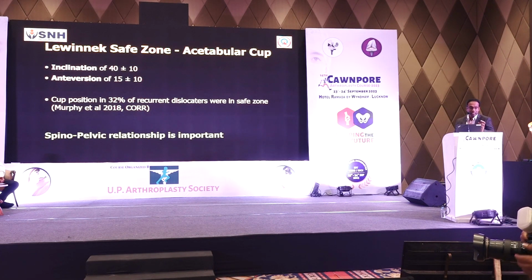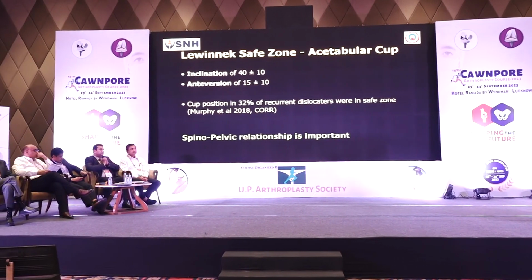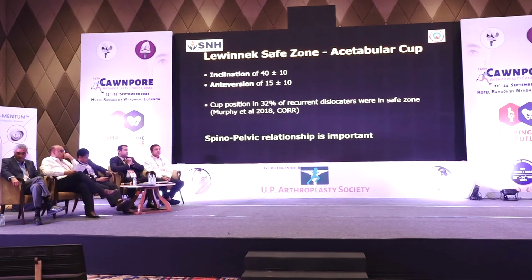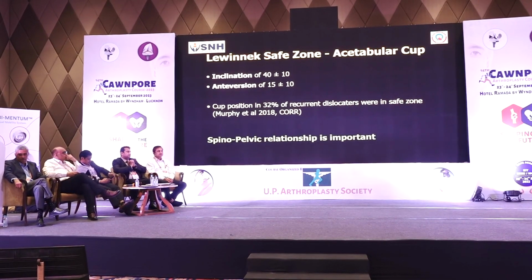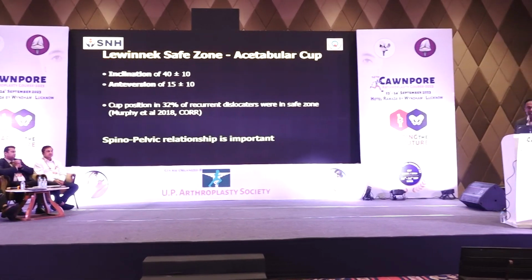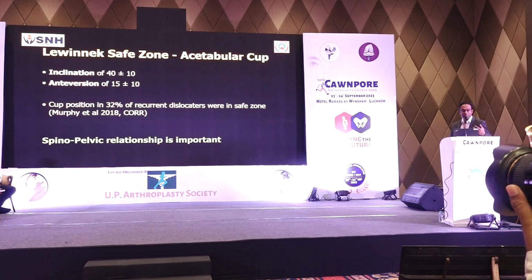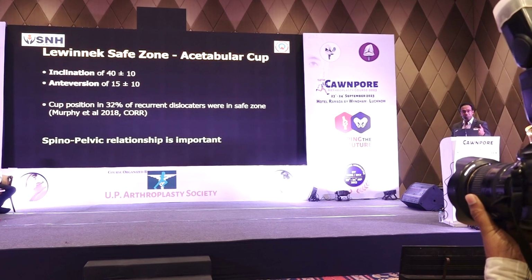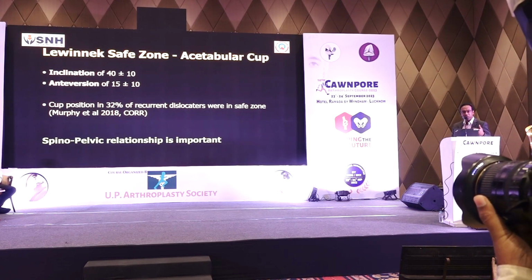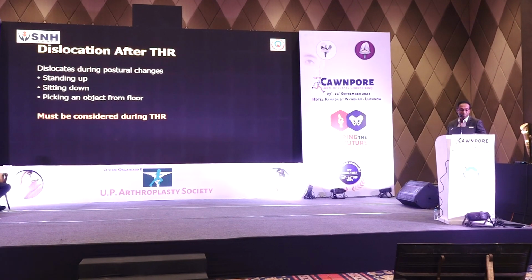Why this comes is that when you put a cup, you are looking at your local landmarks. You're looking at the TAL, you're looking at the posterior wall. As Dr. Mrinal said, I'll leave a little bit of the superior cup exposed and the inclination is fine. The position of the cup is wonderful. But what is the position of the cup in respect to the person, the pelvis or the spine in totality? This is what we have to also see.